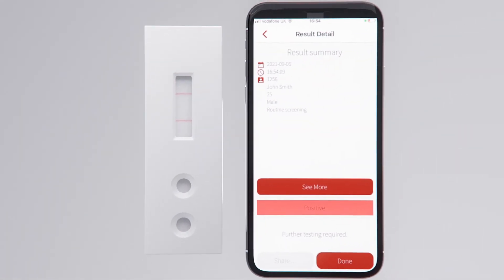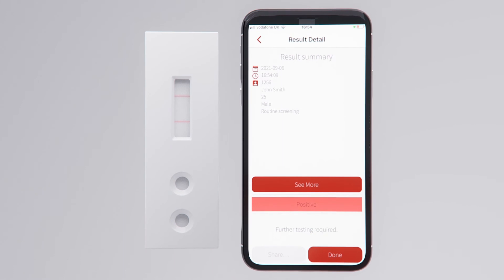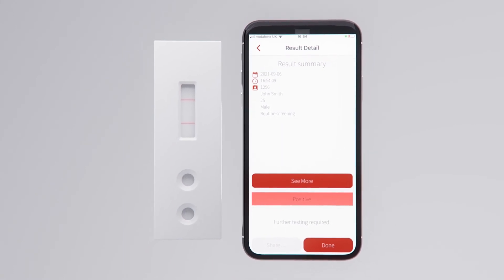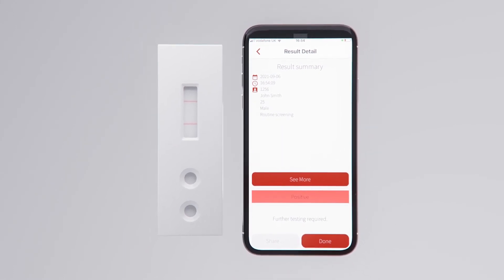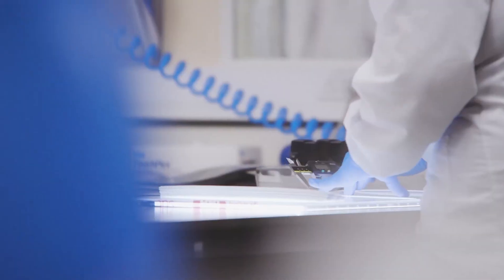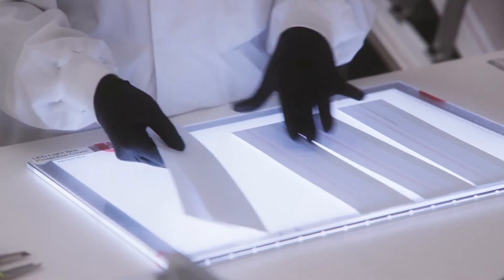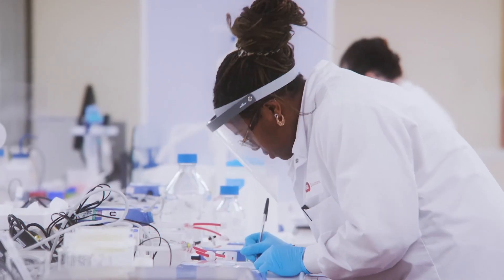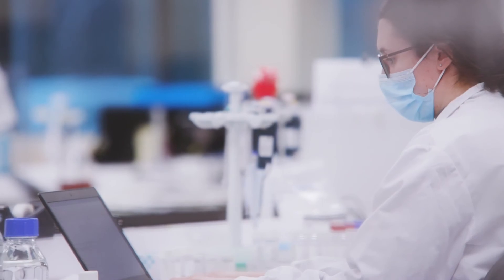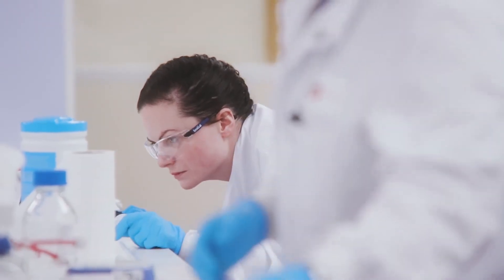Lateral flow assays enable real-time results, resulting in faster decision making, providing peace of mind. BBI Solutions has over 25 years of experience in designing, developing, and manufacturing lateral flow assays, ensuring reliability and robustness.